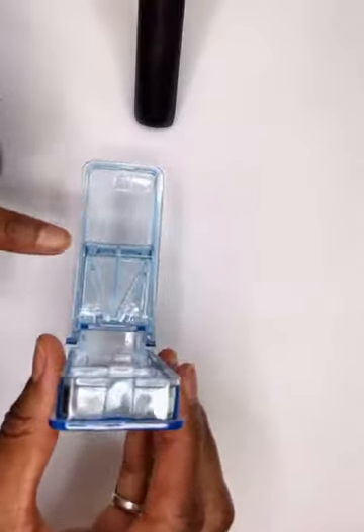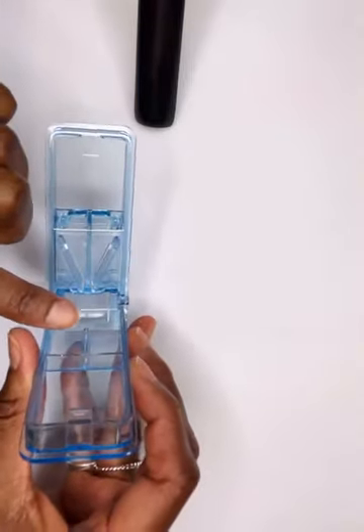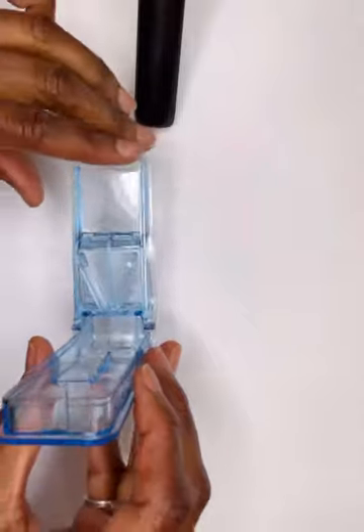First thing you need, what is this? It's a pill cutter. In order to properly cut your pills, to make sure that it's accurate and it's the best and safest way possible, you need to use a pill cutter. So let me show you how to cut your pills using a pill cutter. What you see here is there's a little bit of a V. This is where you actually put the pill in. And then here you got to be very careful because that's actually the blade that cuts it.